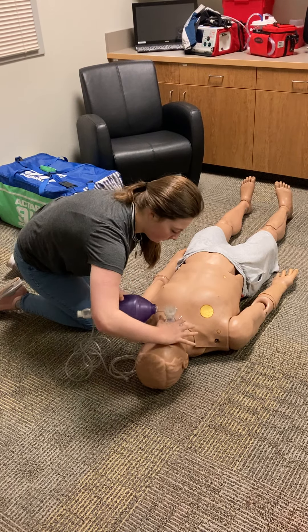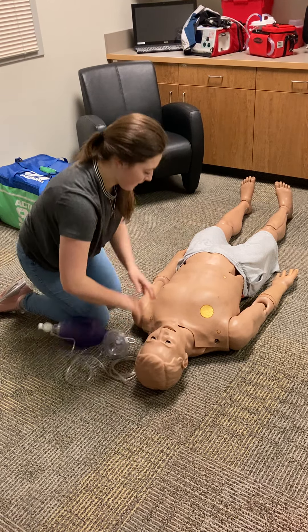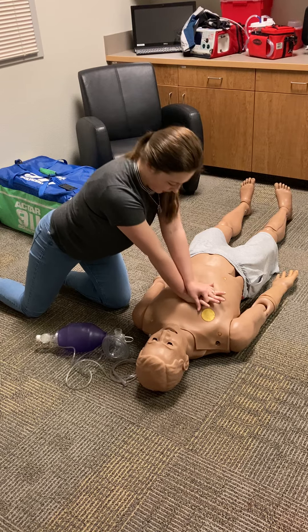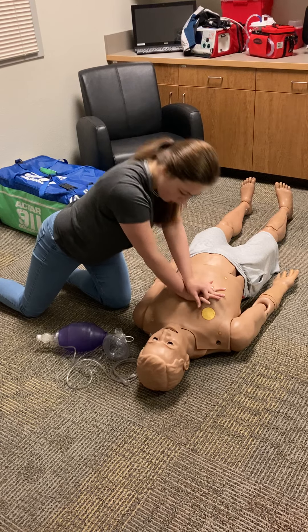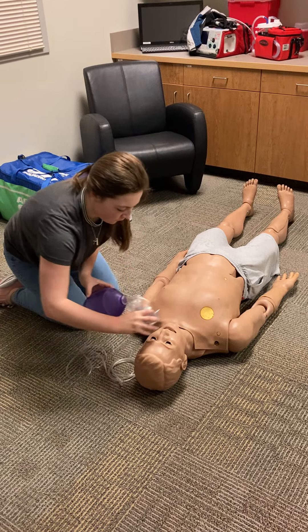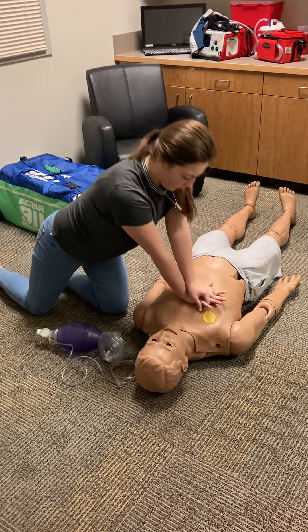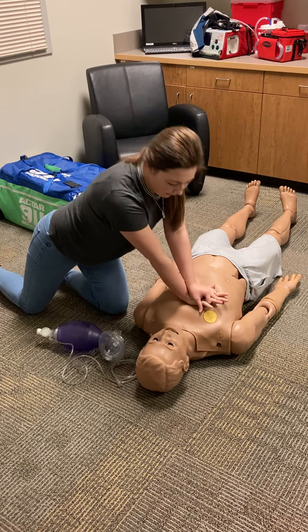1, 2, 3, 4, 5, 6, 7, 8, 9, 10, 12, 13, 14, 16, 17, 18, 19, 20, 21, 22, 23, 24, 25, 26, 28, 29, 30, 31, 32, 33.